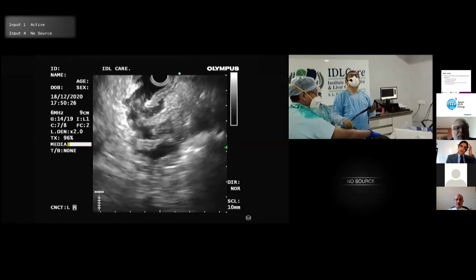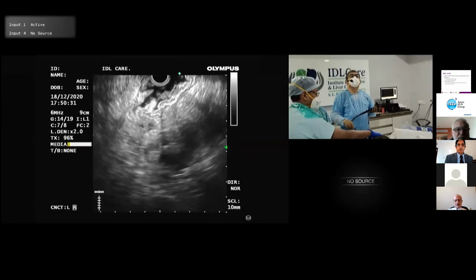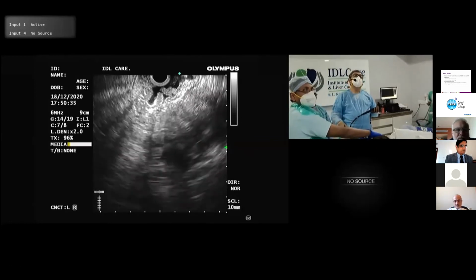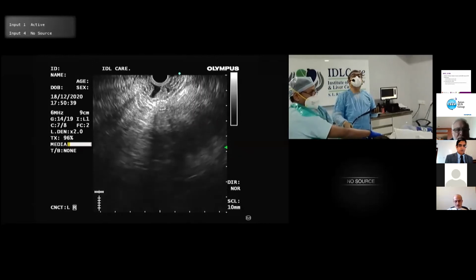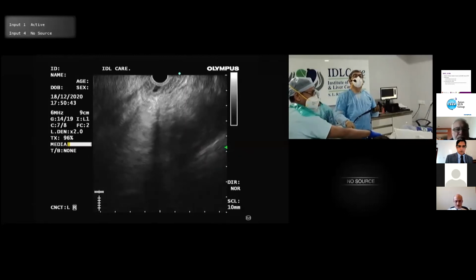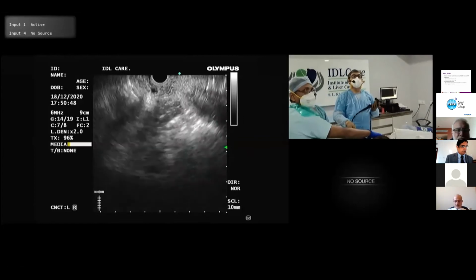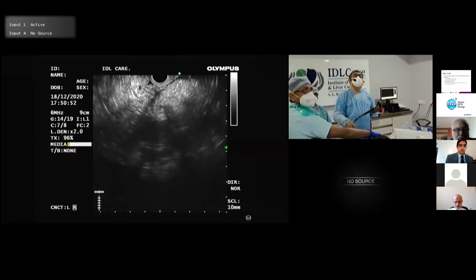Would you consider biopsying any of the smaller lesions from the stomach that you saw earlier? I biopsied the surrounding mucosa and I biopsied the duodenum. The small lesions, I was thinking if need be, I will take them out in toto and not just biopsy them because they are really small. Yeah, so we can do a polypectomy of them. Some of them look like hyperplastic polyps on NBI.